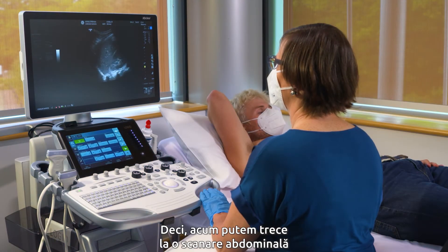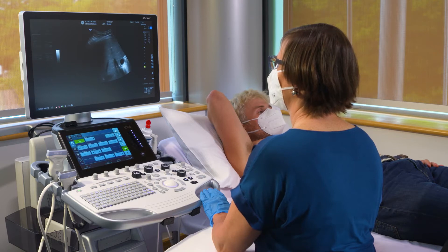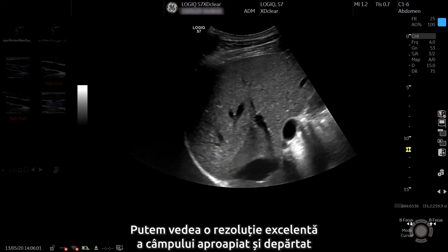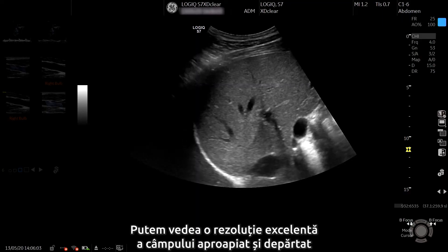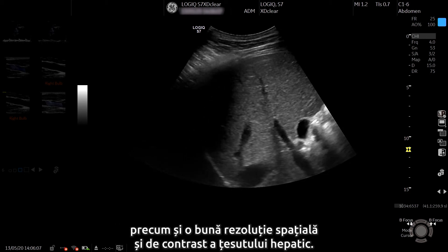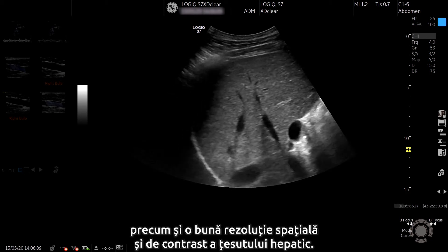Now let's move to some abdominal scanning. We're scanning the abdomen using the XD Clear transducer C1-6. We can see excellent near to far field resolution and image uniformity through the liver parenchyma, as well as good spatial and contrast resolution through the liver tissue.